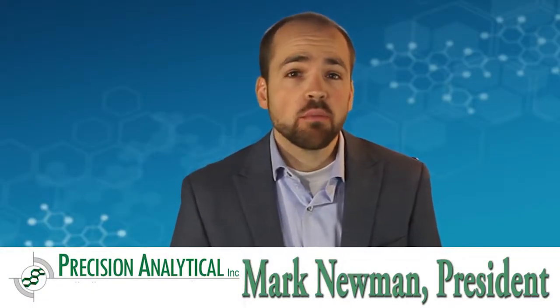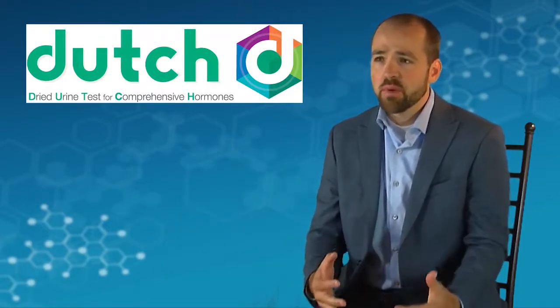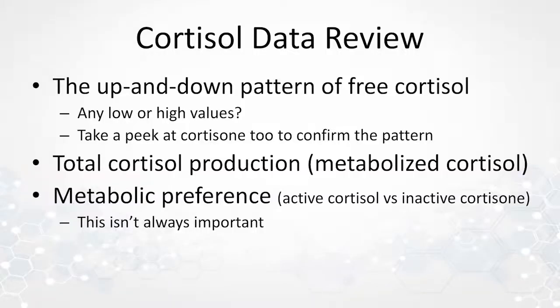Okay, now we're ready to dive into what's probably the most complex piece of the test report, and that is the breakdown of the cortisol and its metabolites. As we break down the cortisol piece, we're going to go through a very basic overview of what we're looking at, and then go through a number of specific examples. If you want to hang through this first part, we'll understand it at a basic level, and then if you have a more complex set of results, you may want to watch the duration of the video to get a handle on some of these different patterns that you're going to see.